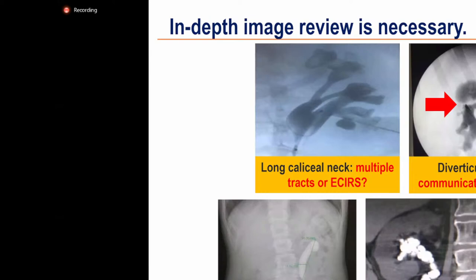The prone position is a quite good option for the upper posterior diverticulum, but the situation can be a little different if it is the upper anterior diverticulum, because we have to penetrate the upper parenchyma to reach there. And as you know, the risk of bleeding can increase and a miniaturized nephroscope device should be considered.